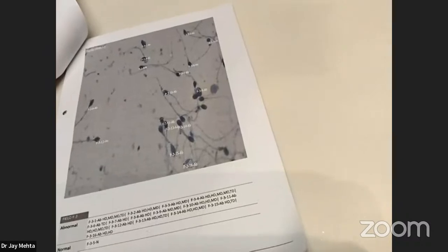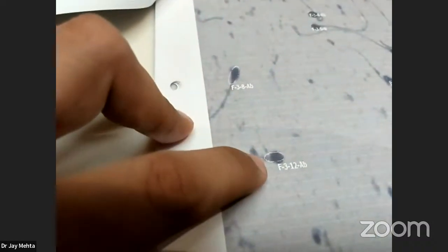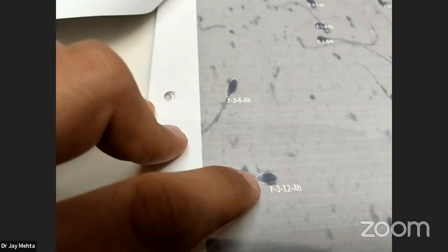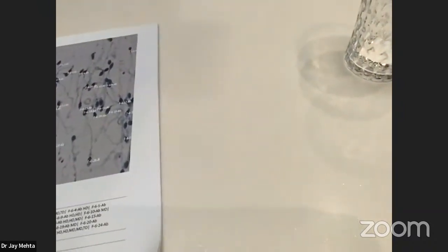When you have an abnormal sperm, it will immediately report it as abnormal, because the algorithm has a fixed diameter for the head. Can you see this white colored diameter which is getting shown on the slide? If your sperm, which is well prepared, fits inside this white colored diameter, that means it is a normal sperm. That's it. Obviously, one can go by these prefixed criteria, which are the best things to go through, because otherwise analyzing these types of sperms is going to become very difficult.